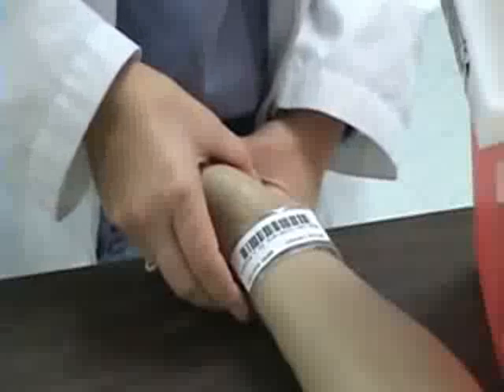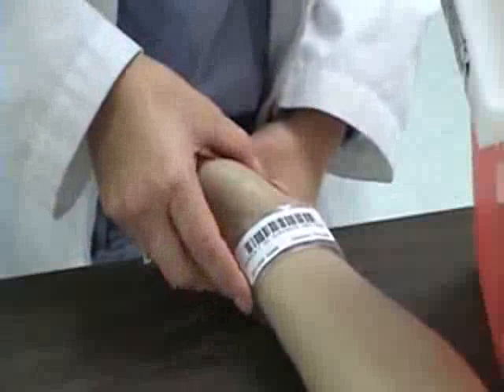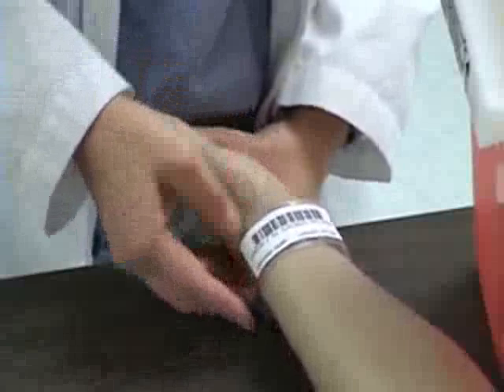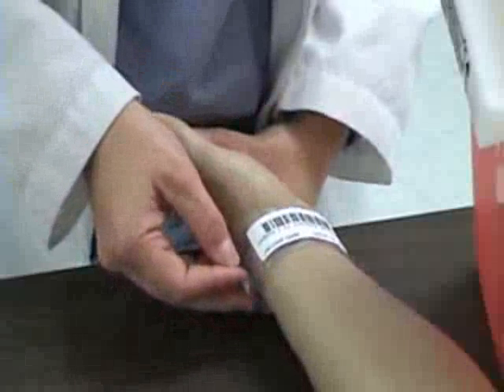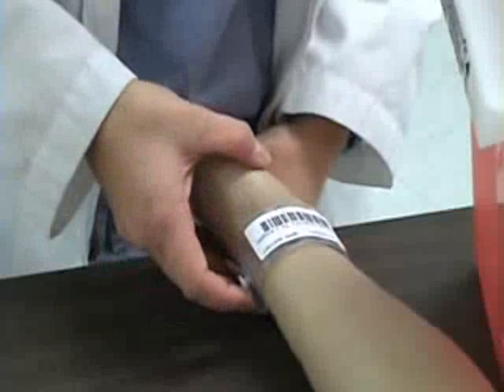At this point, I'm going to go into my patient's room. I need my gloves, my alcohol preps, and my medication. I will enter the room, wash my hands, introduce myself to my patient. I want to identify my patient by asking them to state their name and date of birth as I am looking at their identification bracelet. I also want to ask my patient if they have any allergies.